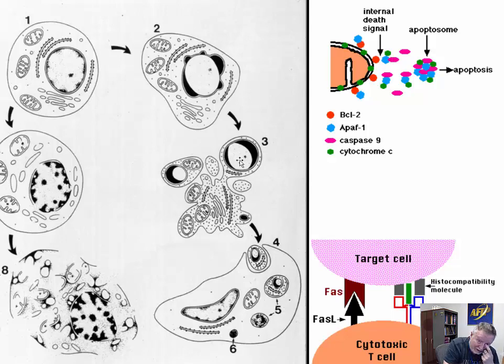It may contain a fragment of this nucleus, but at no time does the nuclear membrane rupture. You don't have the influx. The organelles really look very good. They look like they're in mint condition, except the nuclei are a little ragged with these crescents.